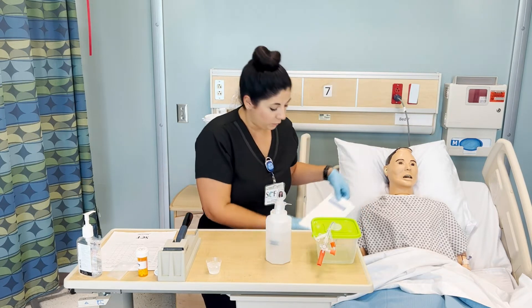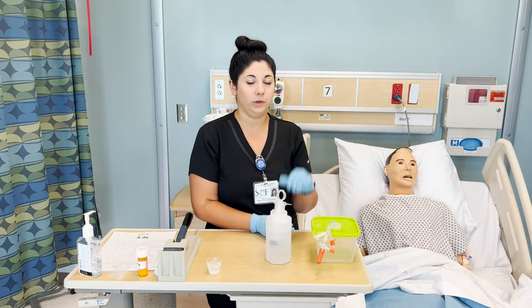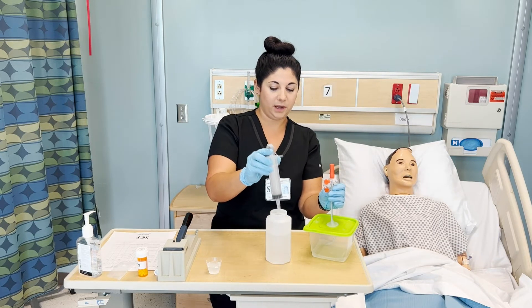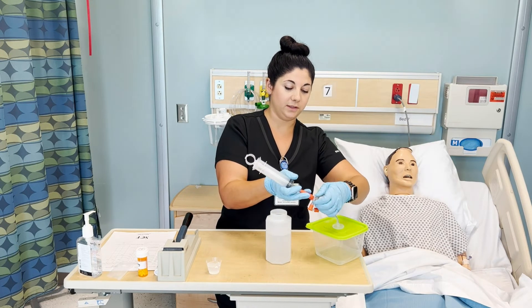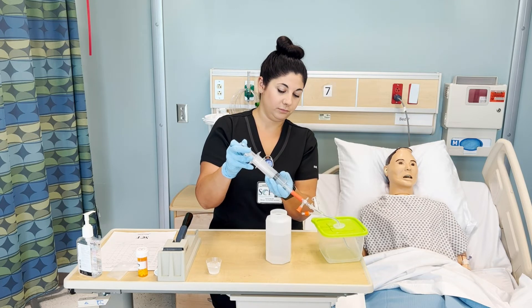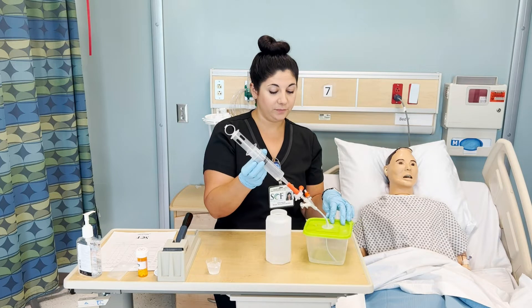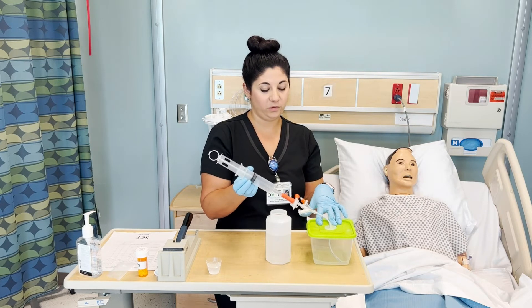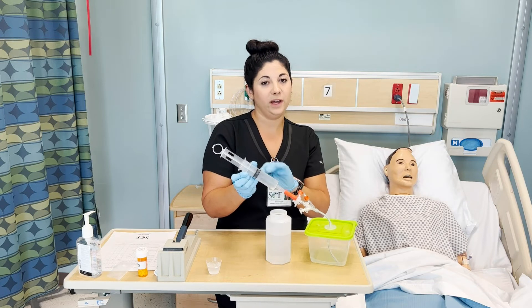While we wait for that to dissolve, we are going to check on our patient and ask them if they're feeling nauseated at all. If they have tube feed going, we'll go ahead and pause that. Then we are going to check our residual. Get an empty syringe, place that right here, and turn the stopcock so that it's open where you want it to be. Gently aspirate, pulling until you're not getting any more fluid out. This is a 60 milliliter syringe. You want to make sure that your residual is less than one hour of the flow rate of tube feeding if the patient is on a tube feed, or 150 milliliters. You'll need a receptacle if you have more than 60 milliliters.